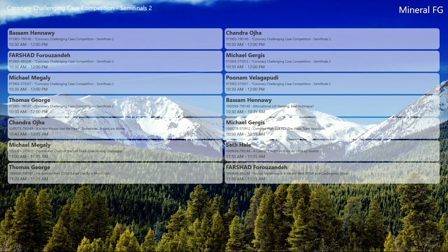I see. I think it was a great result, and I think there needs to be some judgment as to what provides you the best support. And you're doing mini crush, and a 7 French is better. But I guess essentially nearly all the cases that have been presented were done femoral. And just to provide the message, I don't think that complex PCI equates to femoral. Many of these procedures can be done radial. Just something to keep in mind. And either with a 7 French slender or even sheathless can sometimes overcome some of the issues. But I think it's a great result.